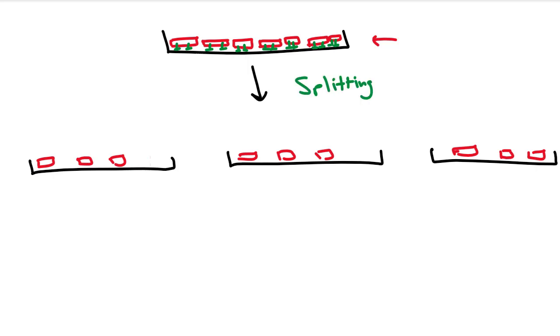Splitting cells. So what we do to keep track of how old our cell culture is, you keep track of the split count. Meaning that, okay, if I was at split count 0 here, now I'm at split count 1 here. Meaning I've split these cells 1 time. So splitting is also called passaging.